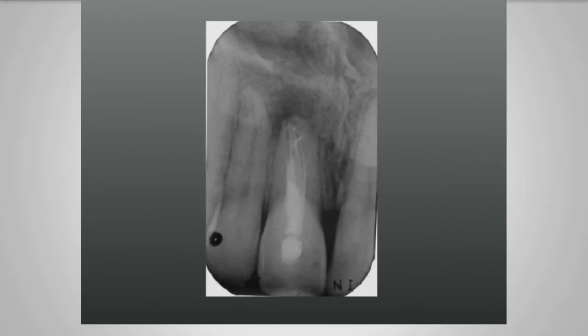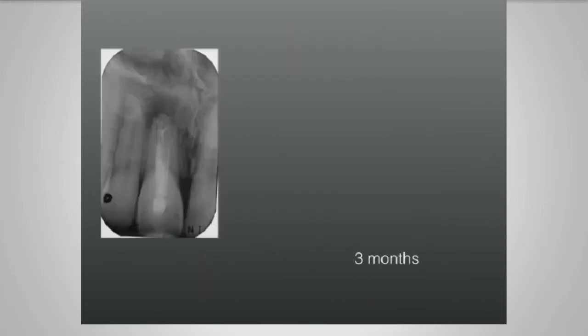So this is the kind of case that we'd obturate using MTA or Biodentine, something like that, where you've got a very wide open apex. And this is much easier if you can visualize it with the microscope, because using a microscope you can see right down to the apex. You can place a membrane or barrier if you need to, and then pack your material onto that.